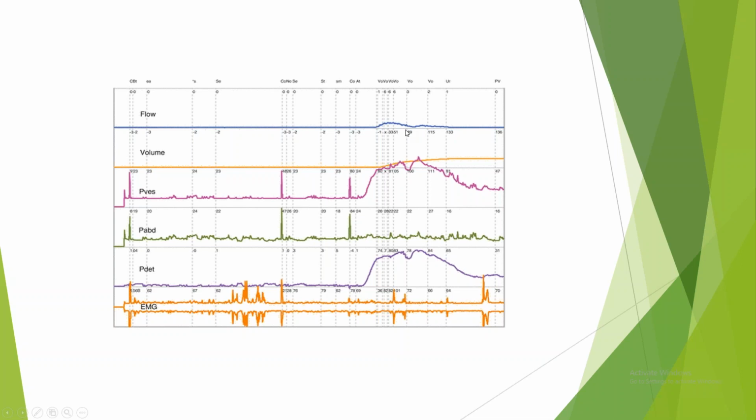Yes, there is minimal voiding, and detrusor and vesical pressure both have increased, but then there is no voiding. So probably it's an outflow kind of obstruction. It can be an outflow obstruction or detrusor overactivity during this voiding phase. Hypercontractility, because volume voided is very less, and Qmax is very less. So it is a voiding dysfunction, might be due to obstruction or due to detrusor hypercontractility.